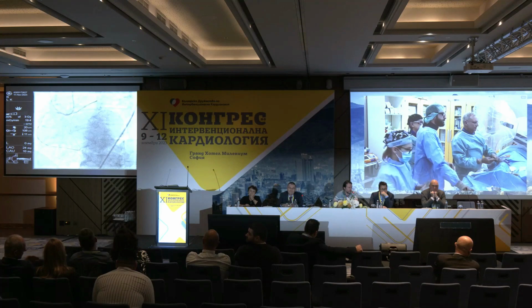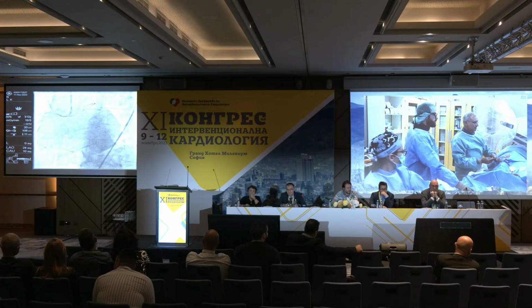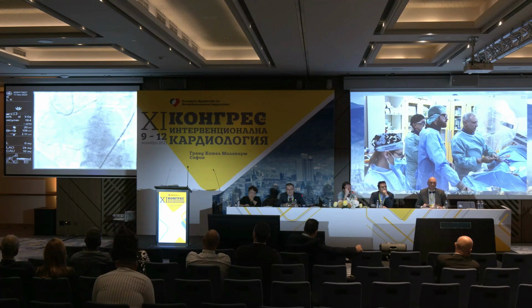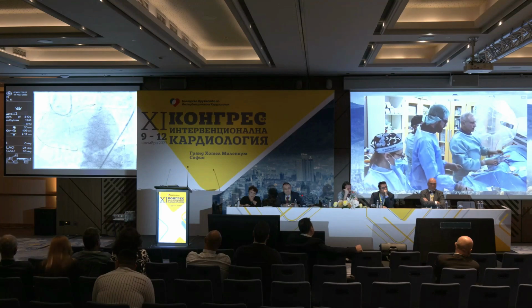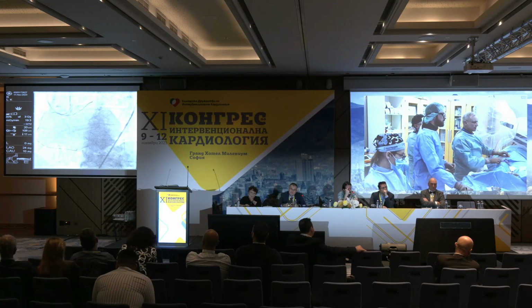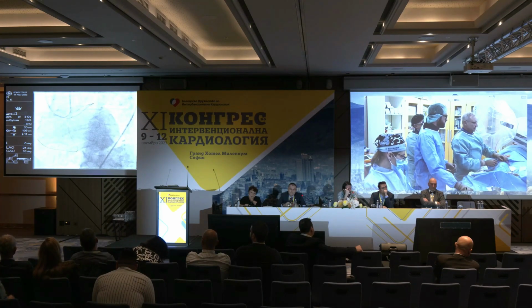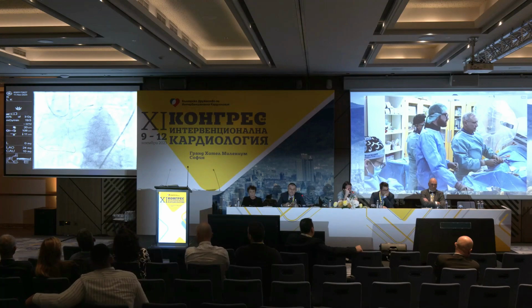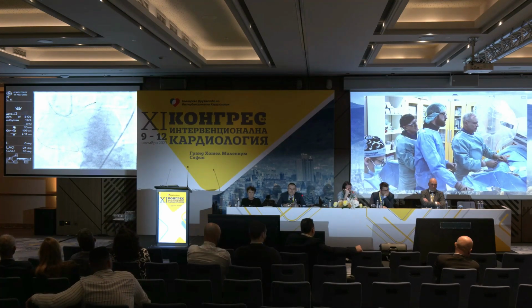I have some difficulties over there. You see that it is subintimal. It doesn't jump into the aorta. But we are in a very good position. What I want to do here is gain a little bit more microcatheter. I'm advancing the guiding catheter. I will try to advance the microcatheter if I can, but without losing the wire position. That's also another critical thing.